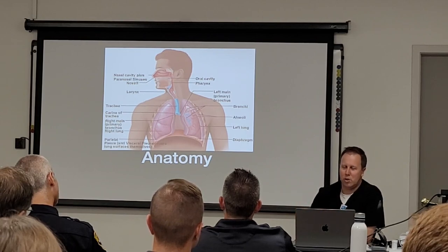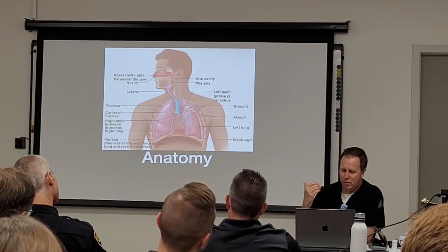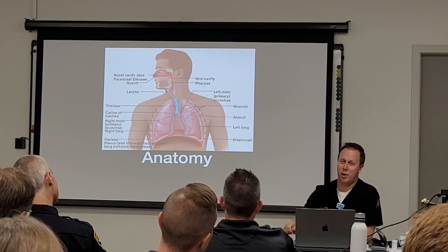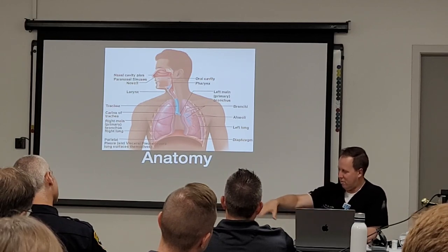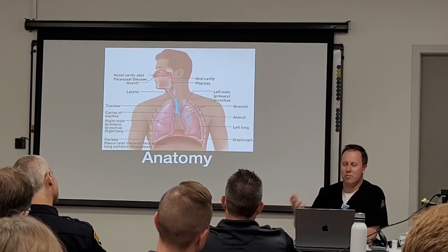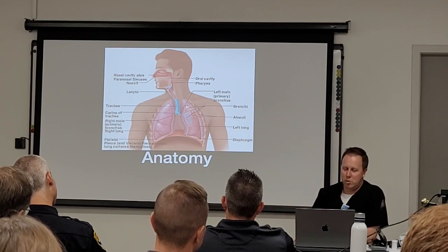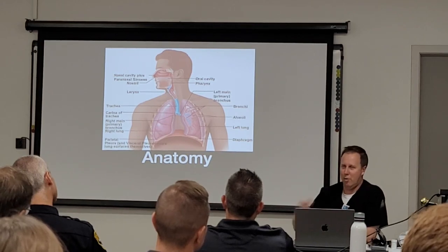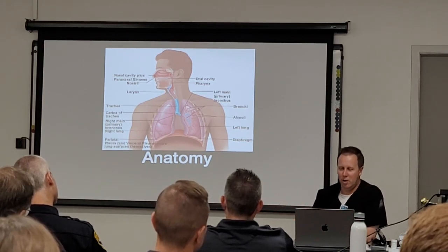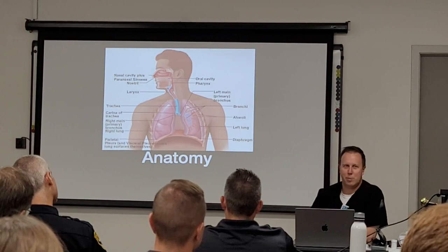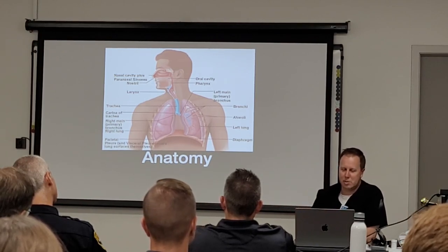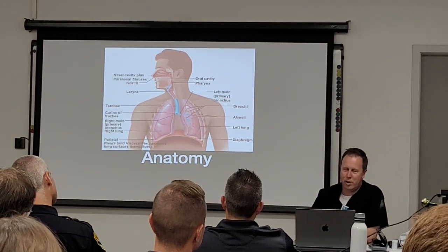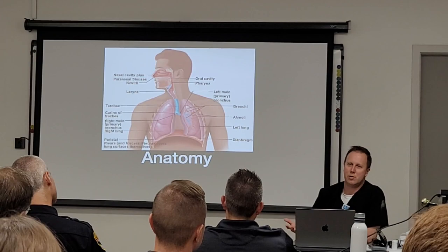When you first learn to intubate you get really excited and you drive it all the way in — you will very adequately ventilate one lung but maybe not the other. You can mainstem these; we'll do that on purpose to show how that looks different, why it might sound different, and what adjustments to make. We'll also pour some water down a couple of the tubes after we get them hooked up so you can hear what coarse lung sounds are going to sound like.